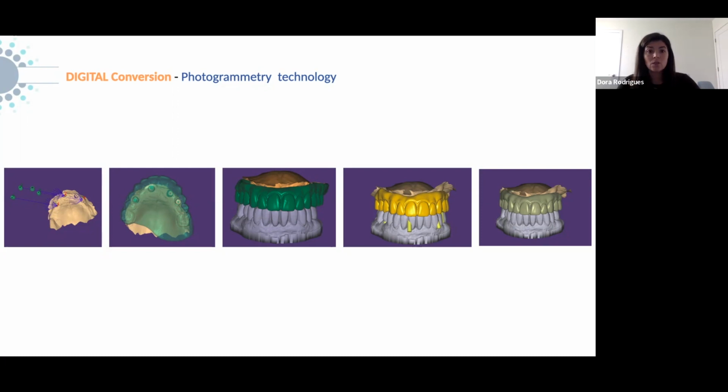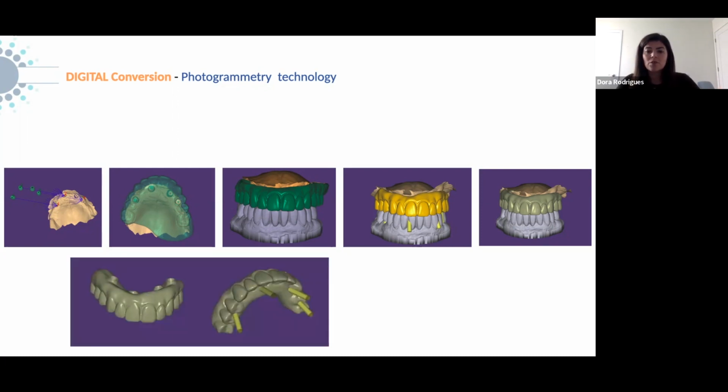That's why I don't dig so much into it, because it can be very overwhelming. It was for me at first, definitely. But basically you bring all your data together, and from your denture design, you basically just do what you normally do with a burr. You cut your flanges, you cut your cantilevers, you smooth the intaglio, and then you just send your restoration to the printer, ready to insert.